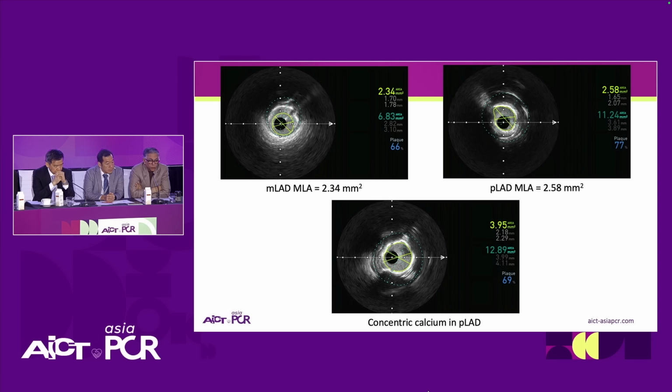I think the only issue will be that the lumen, as Jason pointed out, is pretty big. So if you go even with a 1.75 burr, which I think absolutely I agree with Mark, that's a good starting point, you may not get as much ablation as you would like. And so then your next option will be to either upsize the burr, or think about using orbital, or go with device combination or synergy, which means you do some rotablation and then you do something else after that, cutting balloon or IVL or something. So that's how I would think about it. Okay, so in this case, you're okay with starting with a 1.75? I think so, yeah, I agree.